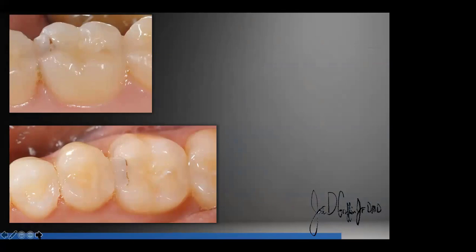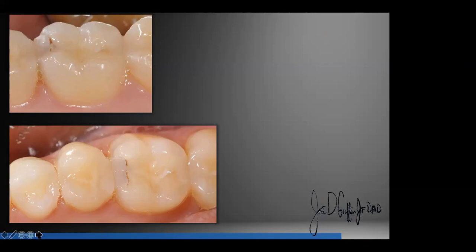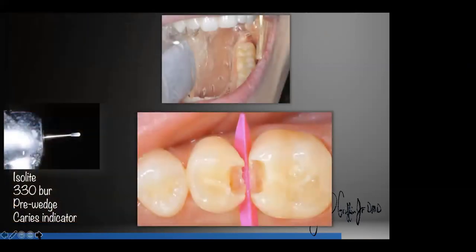Let's start with the basics — direct restorations. Here's a simple one: a Class II restoration, interproximal lesion, recurrent decay. Patient walks in at cleaning and exam and says they can't floss one area and feel something moving. You can see what's going on — somebody did a composite and it came loose. Something came loose, there's a reason why. We're going to numb the patient and isolate. A lot of you use a rubber dam — that is the best; there is nothing that isolates better. However, according to statistics, almost 90% of you don't use a rubber dam routinely for restorative dentistry. I don't either except for endo and cementing large veneer cases.